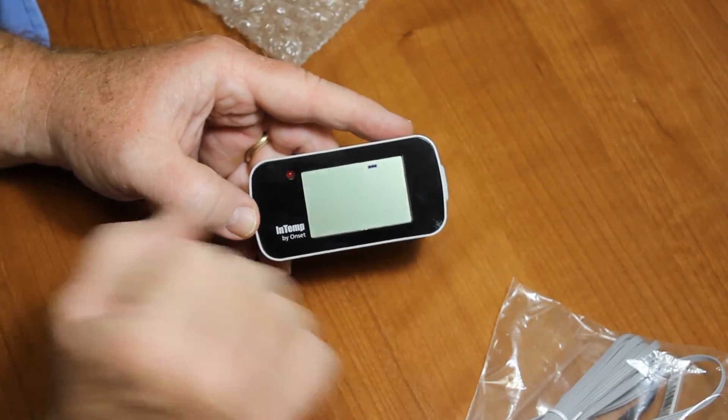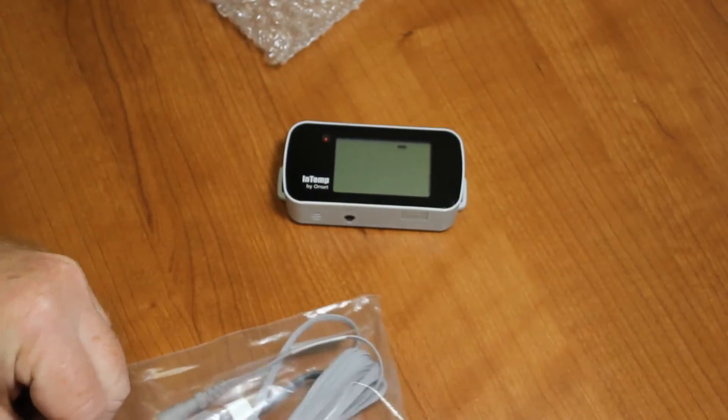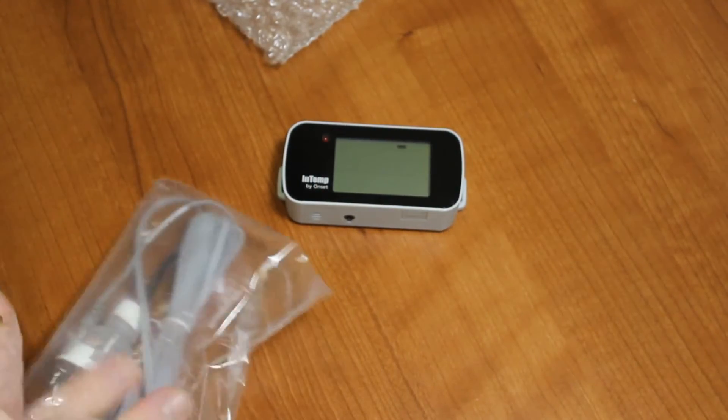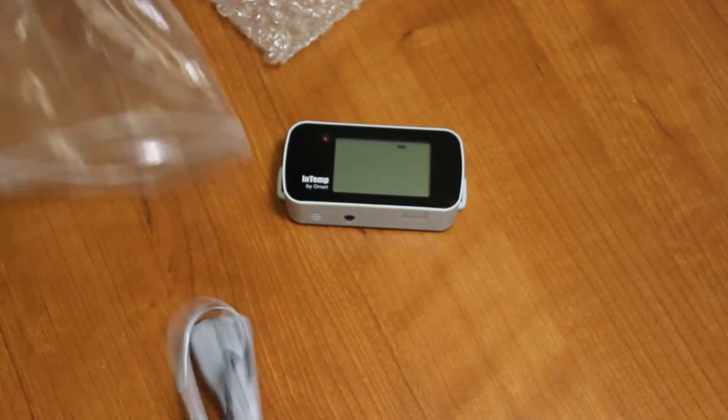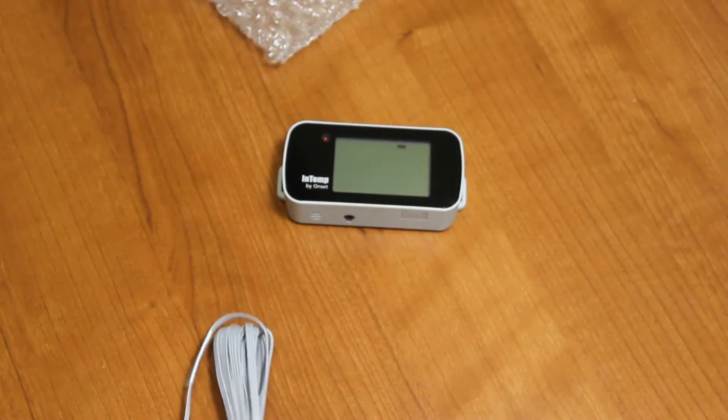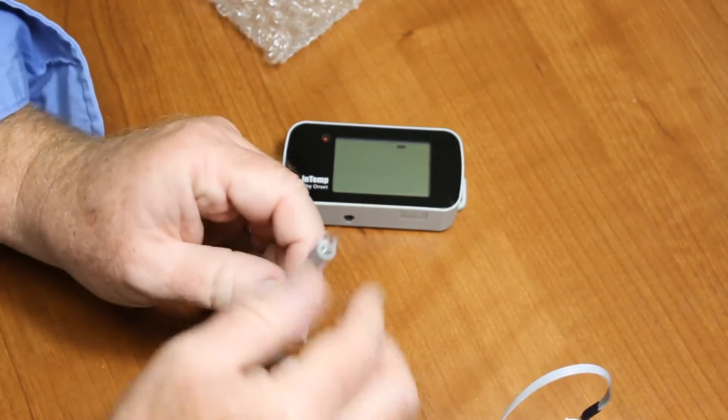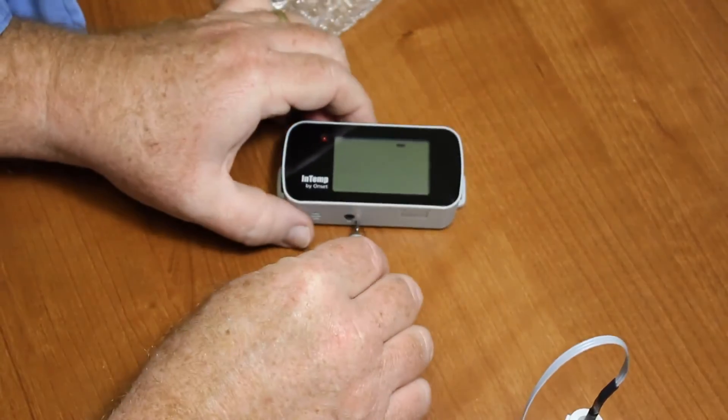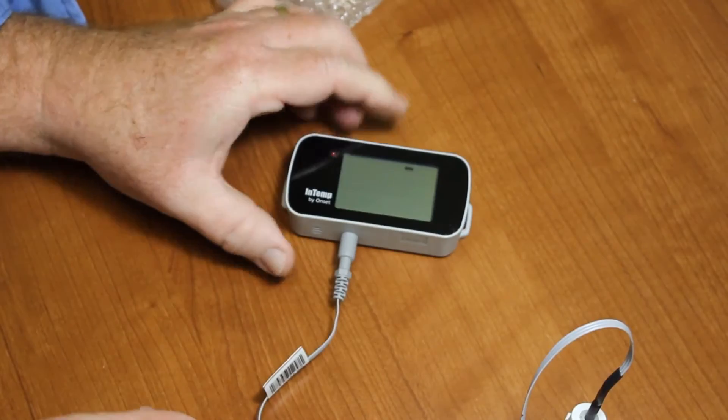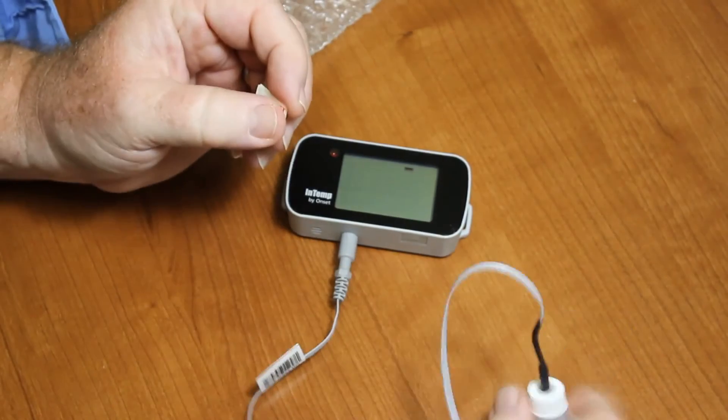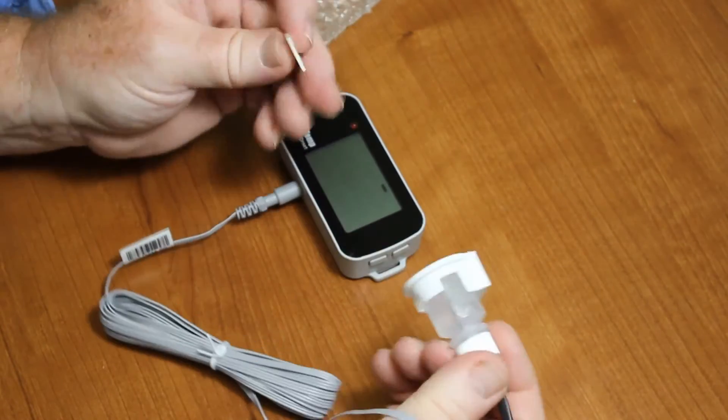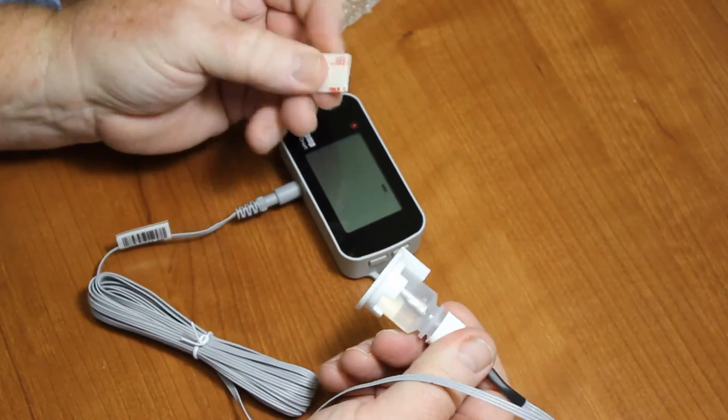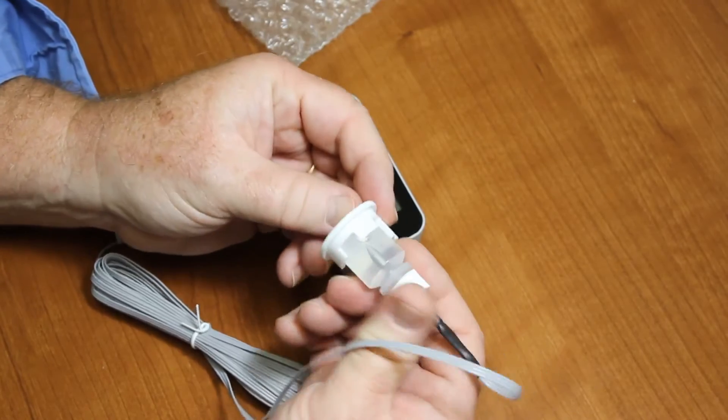The next step is to plug in the external temperature sensor. Obviously, if you have the model of CX-400 that doesn't have this, you don't have to do this step. There we go, that's plugged in. Here's our glycol bottle with the holder, and we have a little double-stick tape we can stick on the bottom of this if we want to adhere it to something.